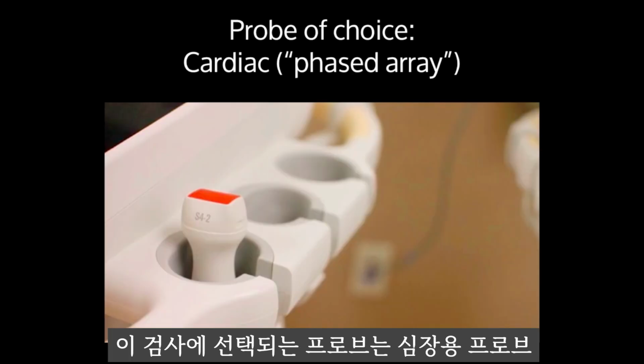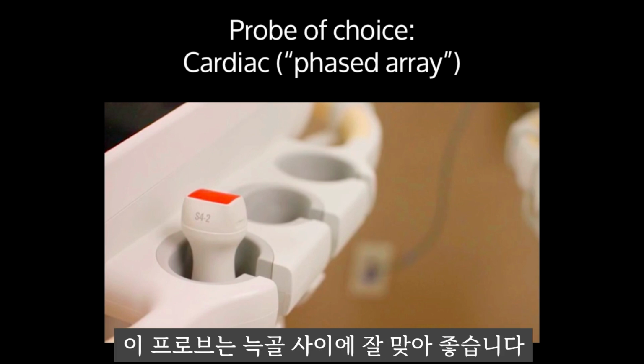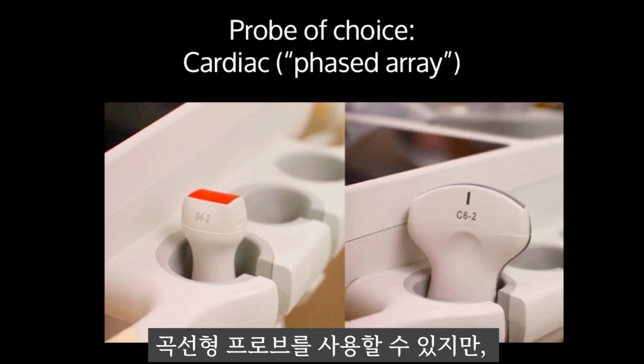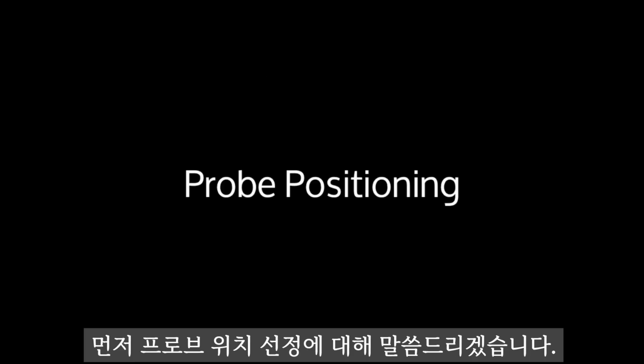The probe of choice for this examination is the cardiac probe, aka the phased array probe. This probe is great for fitting in between the rib spaces. If your machine does not have this probe, the curvilinear probe can be used, but really the preferred probe is the phased array probe. First, we need to talk about probe positioning.